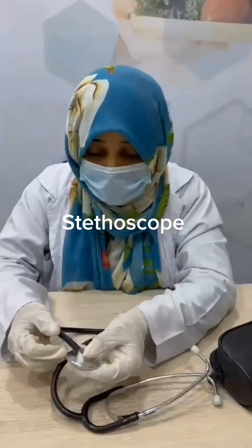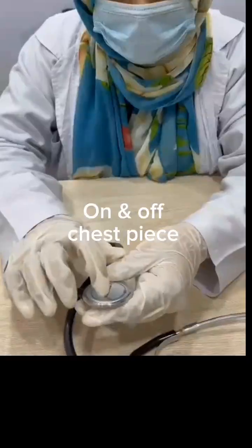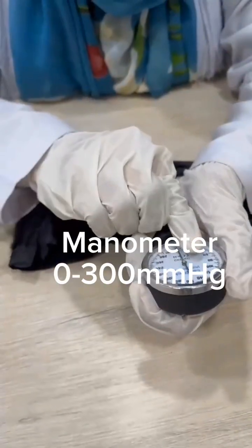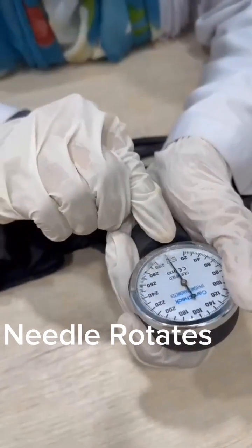Today I'm going to discuss the BP apparatus and stethoscope. This is the diaphragm of the chest piece, on and off, earpiece, and manometer. Minimum reading is 0 and maximum is 300. The meter rotates around the readings.